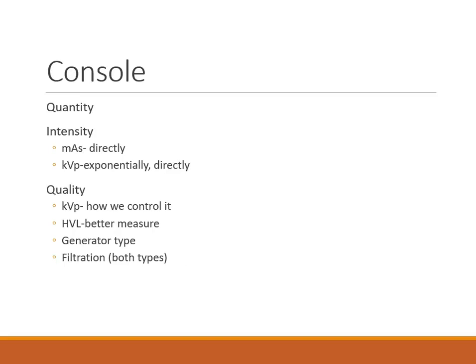And just for hypothetical, that 25 mAs generates maybe 100 mR of exposure.